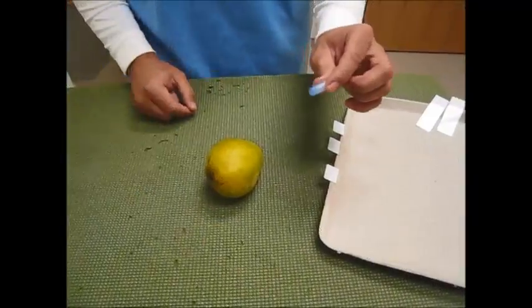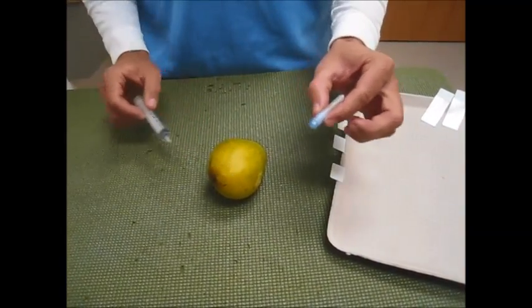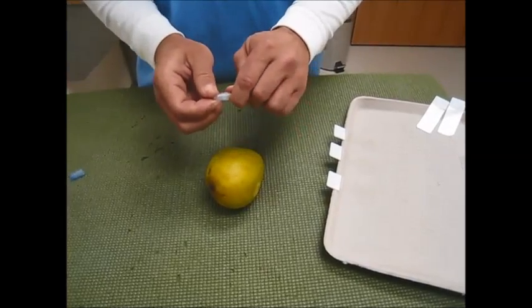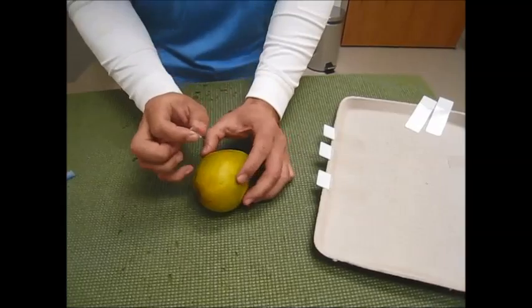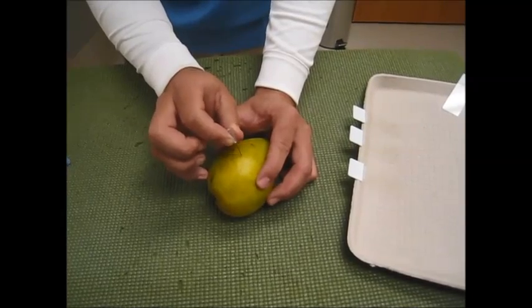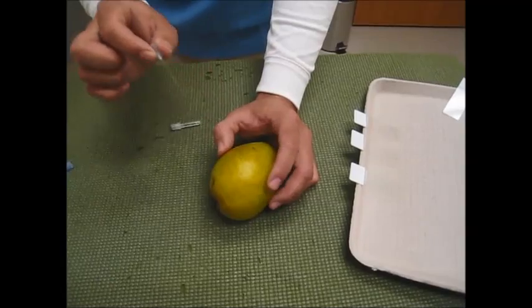For this technique we are not going to use any aspiration. We're going to still need a 6 or 12 cc syringe and a 22 gauge needle, but we're not going to attach a syringe during the sampling. We take the needle without any syringe attached, firmly grasp the item to be aspirated, and gently poke changing directions to get representative material, then pull the needle out.